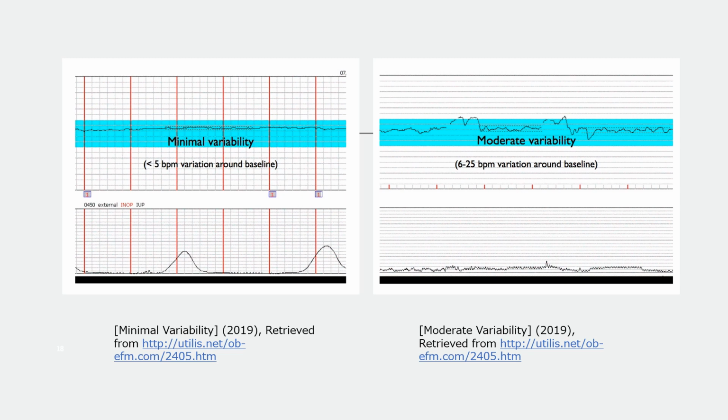And that's why it's important to ask the patient, did you feel the baby move today? Did you just smoke a cigarette? You're trying to figure out why it might look like this. What's her due date? Is she like a week over her due date? What's going on?